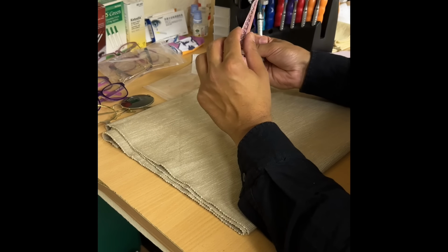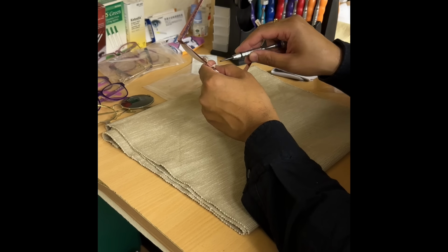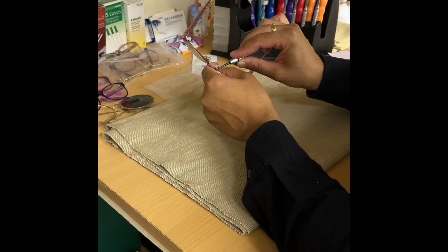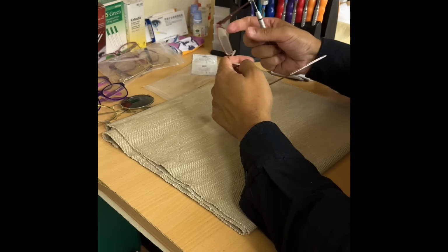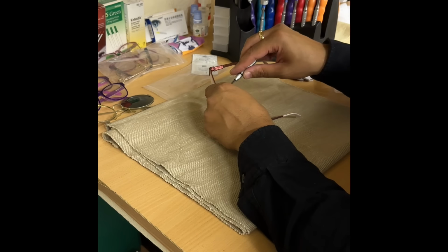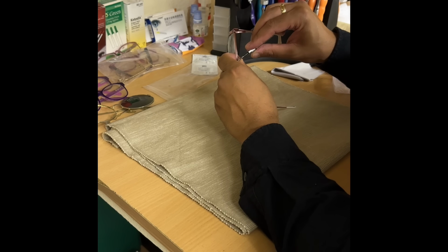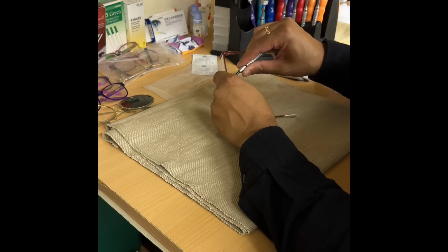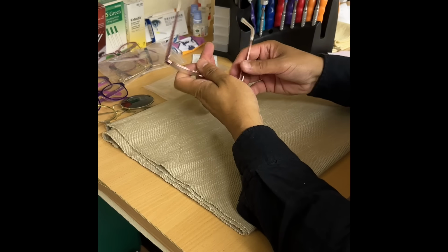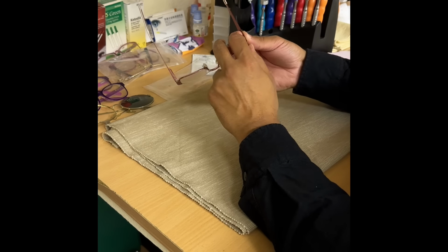Lens is intact. We did say we'd tighten up the pad screws here. Looks like that one's already quite tight, lovely. That one's got a little bit of give. That's much tighter. Alright, so that side is a little bit out of shape.